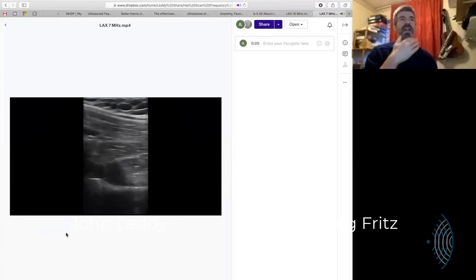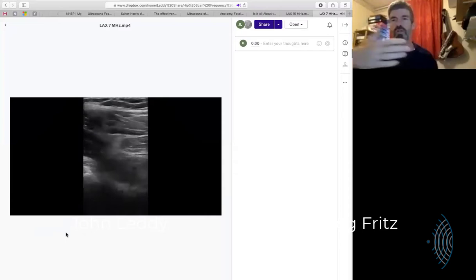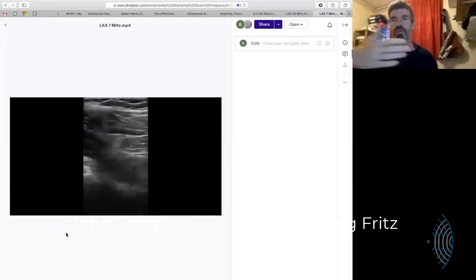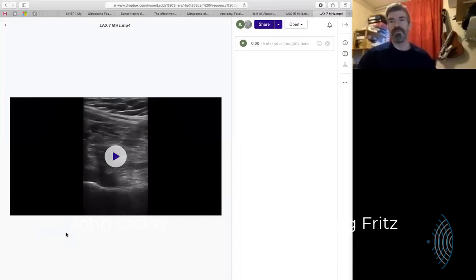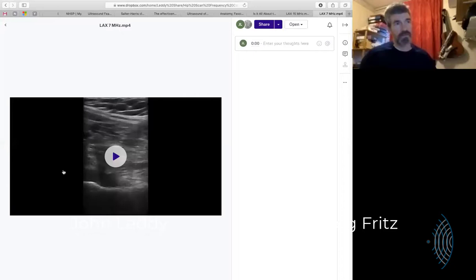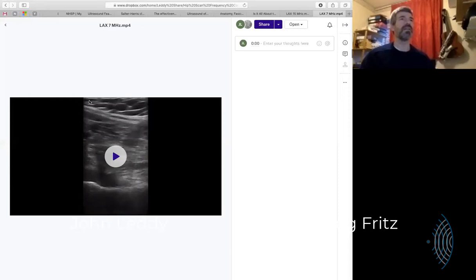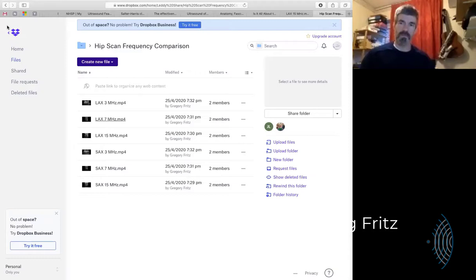Better views on this scan. I'm oblique on the neck so that I'm not getting it clear enough and distinct enough as a periosteal brightness. And also as you're scanning around, you're going through the brightest — you're getting a bright line but then you're immediately moving off it and slicing suboptimally on the slices either side. And in this case you're probably not visualizing the acetabulum.